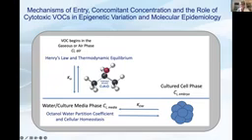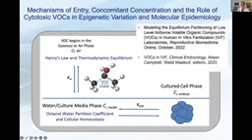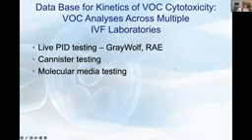It's really Henry's law of physics, which I won't go into now, but again, a fascinating topic, as well as thermodynamic equilibrium that's going to help drive that IPA into the oil overlay and then eventually into the cell culture media. Once in the media, yet another law of physics comes into play, your octanol-water partition coefficient, as well as cellular homeostasis. Depending upon the individual metrics of the VOC and the environmental conditions, that can help drive those levels into the cellular state or within the embryo itself. Again, much of our most current work is being published in the next couple of months, and we were honored to be invited to share some of that information in the new textbook coming out in '23, Clinical Embryology. A lot of our data comes from multiple sources, most of which are IVF labs in North America.